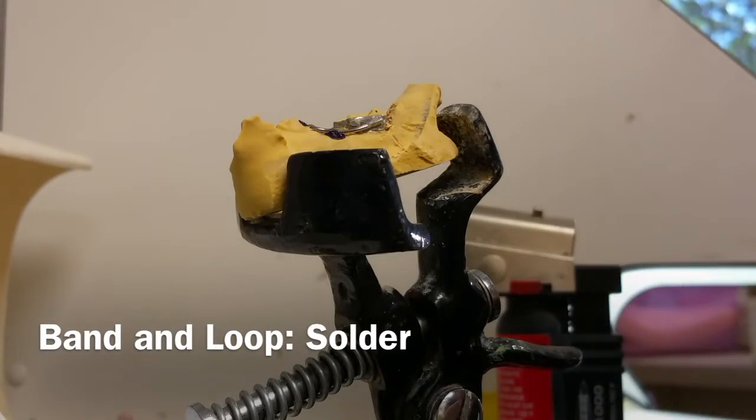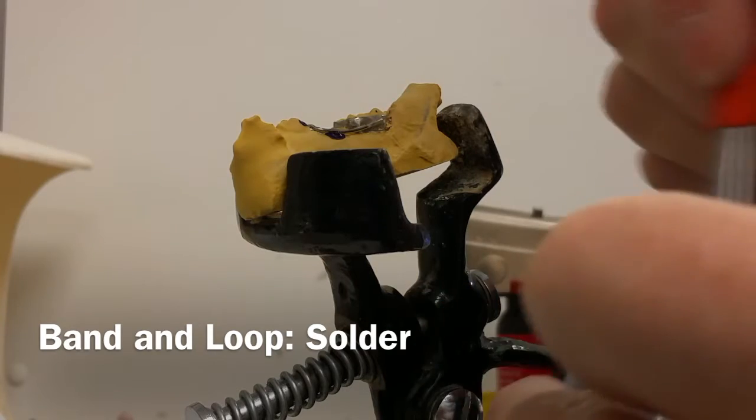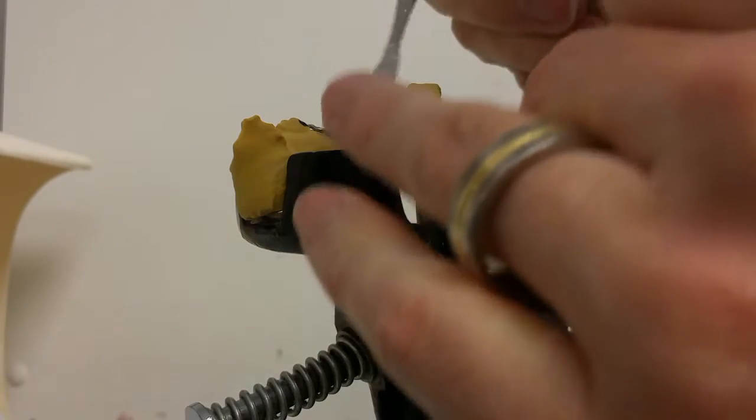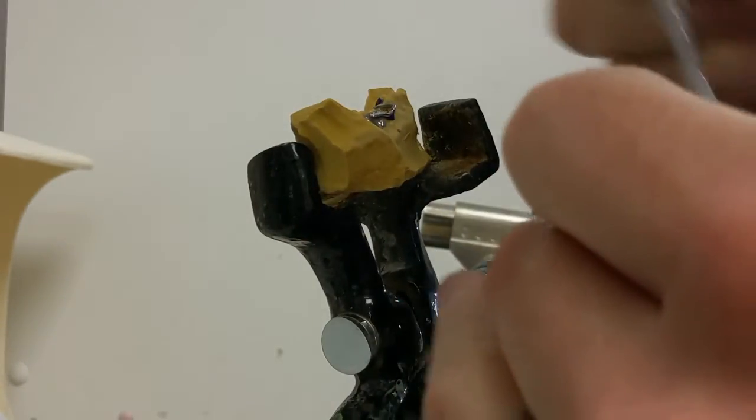Continuing the band and loop series, today is solder. Pretty easy, just four simple steps. First step, apply the flux. I'm using this flux from JBC. It's pretty good, pretty smooth.